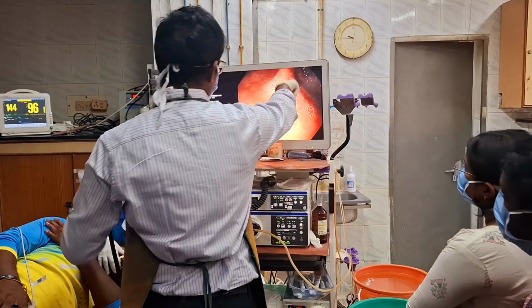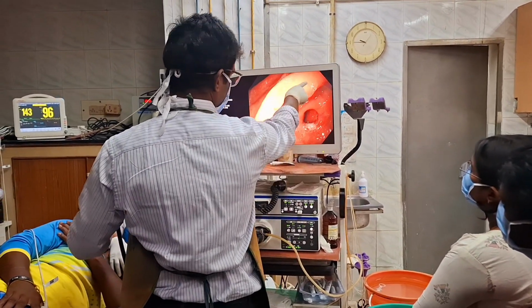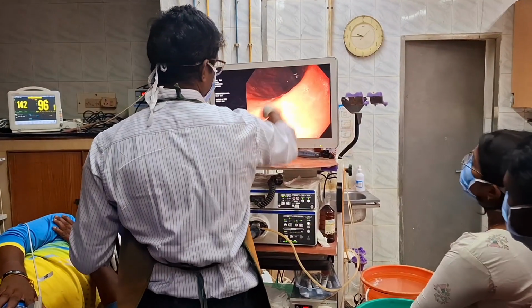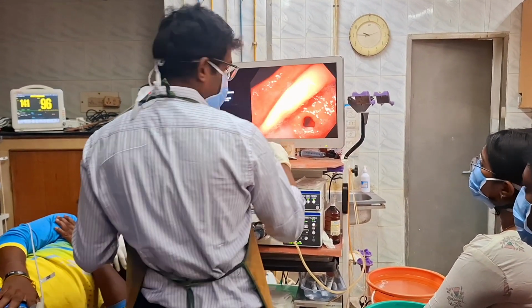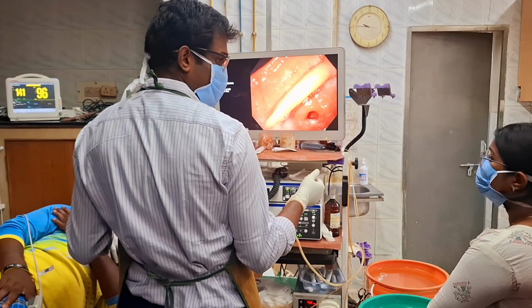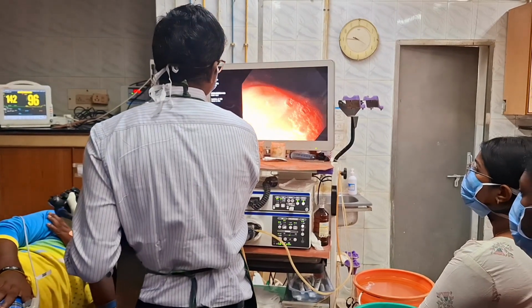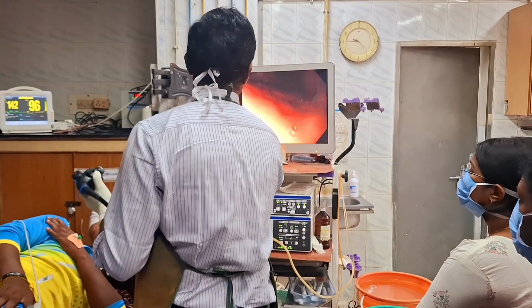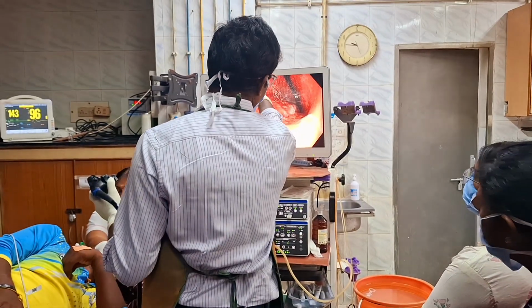So you can see a bridge-like structure is going. See this bridge. This area is the incisura of the stomach. Incisura will be along the lesser curvature only. So you can see when I go here, this layer is a rugal fold, that is greater curvature.